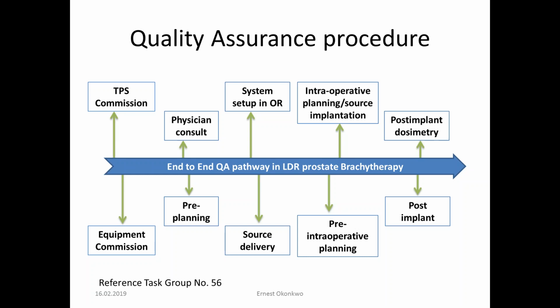So as I said, I'll go into all those things. Commissioning, which was mentioned, is one of the most important quality assurance activities that you can do to prove that the system specifications are accurate.